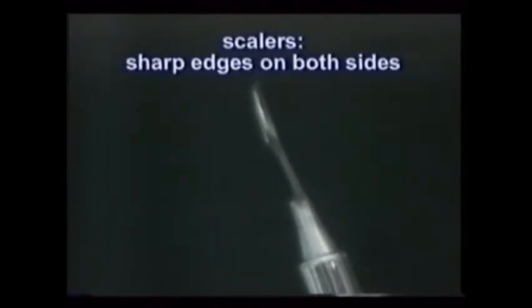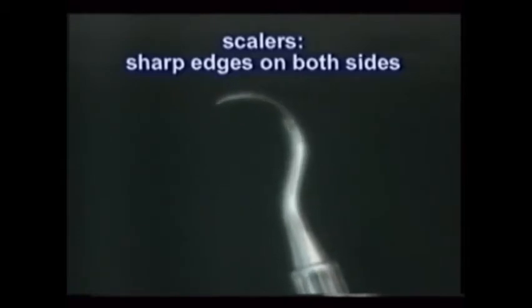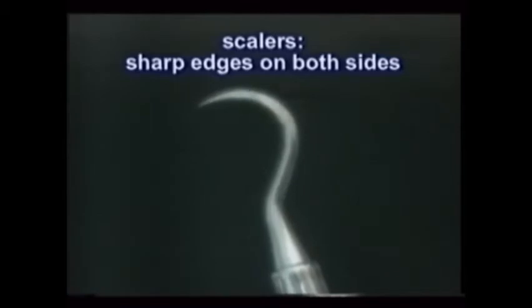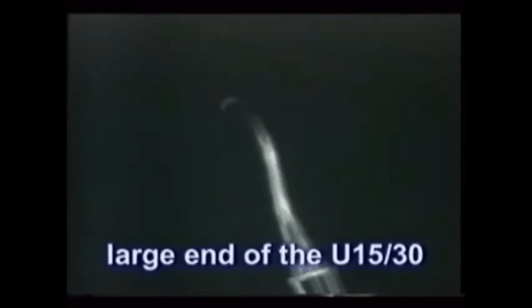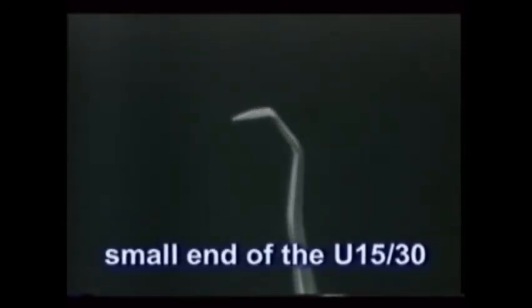Scalers are defined by name or number. They can be universally used on both sides of the mouth, top and bottom, as their blades have sharp edges on both sides. Some scalers, like this sickle-shaped U1530, have unique pointed blades that access particular teeth. In this case, the tight confines of the lower incisors.